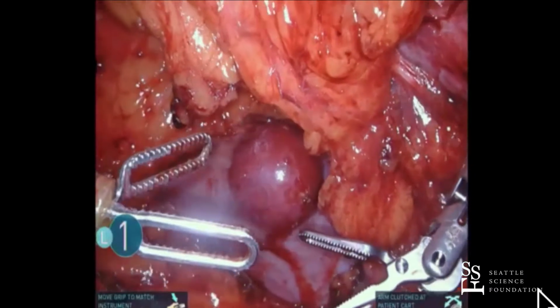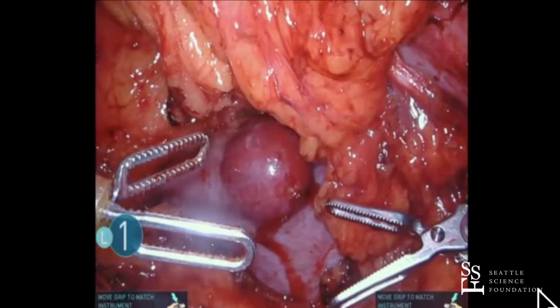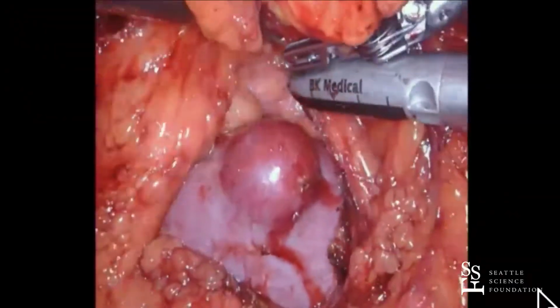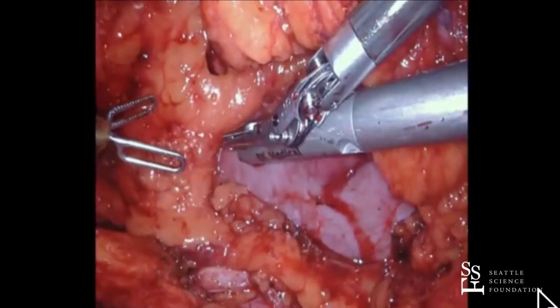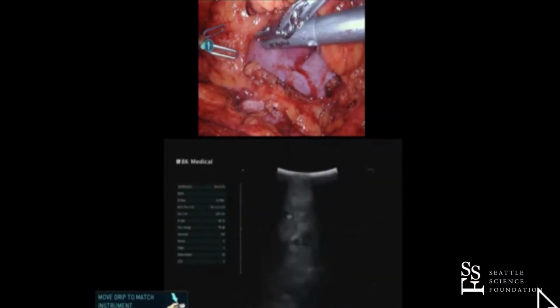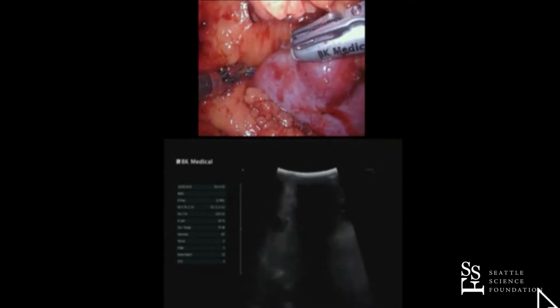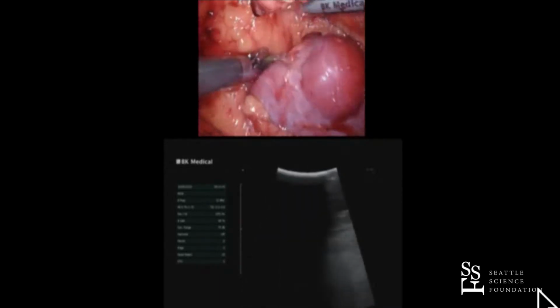So we're going to bring the ultrasound back in. Jim, while you're doing that, when do you decide to leave some fat on the tumor versus send the fat overlying the tumor as a specimen? What's your thinking with that? Are you asking me or the panel? Both. If it stays on, I'll leave it on, but if I tried to use that fat as a handle, it wouldn't be much of a handle. It was ready to come off. So I leave it on if I can.